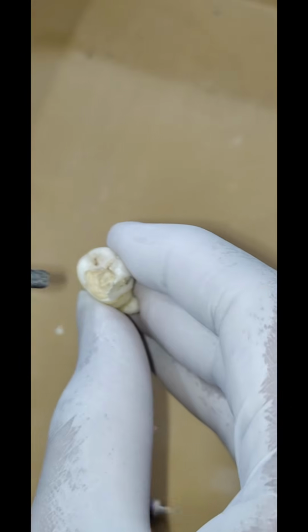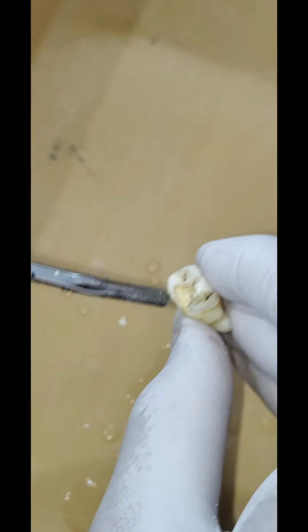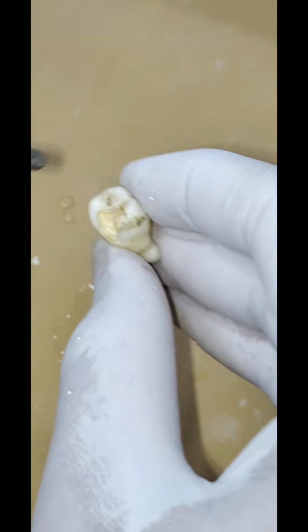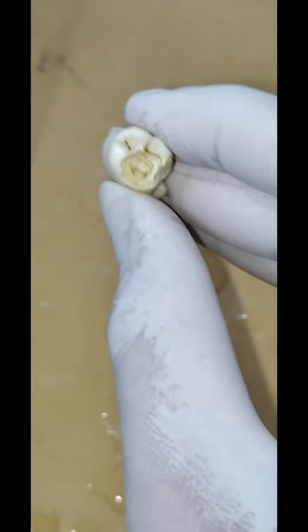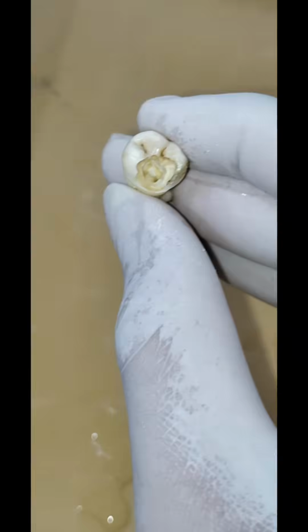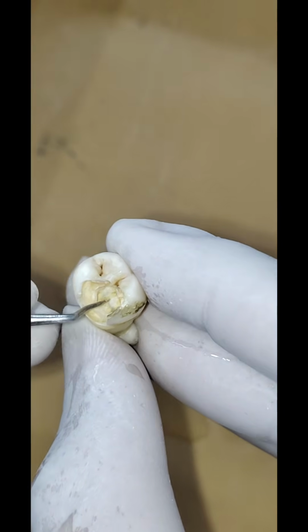You're able to see all the clean walls. Again, here I'm using the air pressure, but do not do that in the clinical scenario. I'm doing it here because it's an extracted tooth, but in the clinical scenario, never do that, because if the air is entrapped into the deeper tissues, it can cause air emphysema.